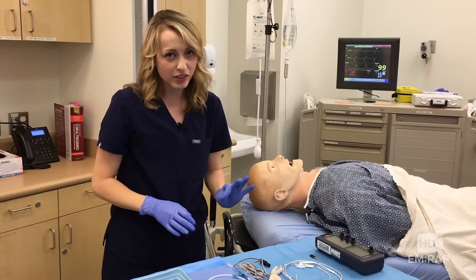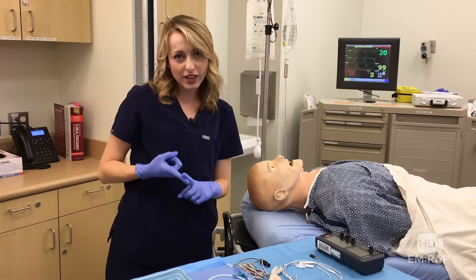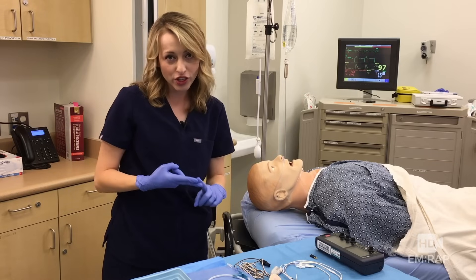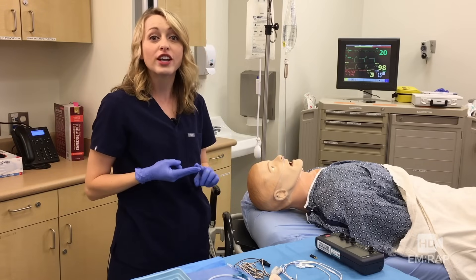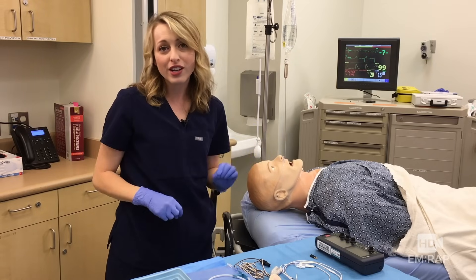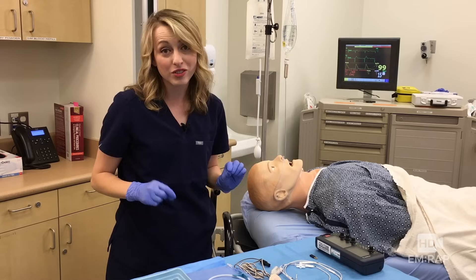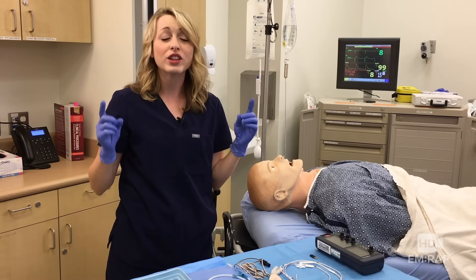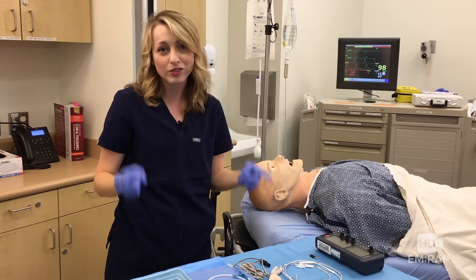Now the only hard part about this procedure is remembering what gets connected to what, what are the settings that you're going to put on the pacer generator, and the pattern on the cardiac monitor that we're going to look for to know that we are in the right ventricle for sure. We've got your back on all those things, so let's start by looking at a quick schematic overview of what those connections should look like when you're all set up.